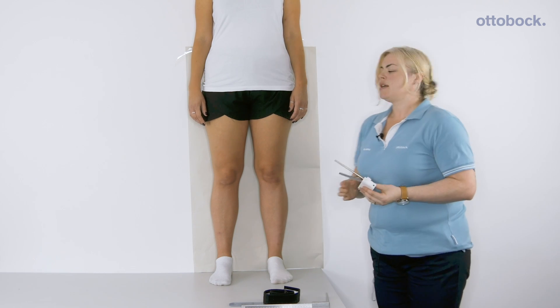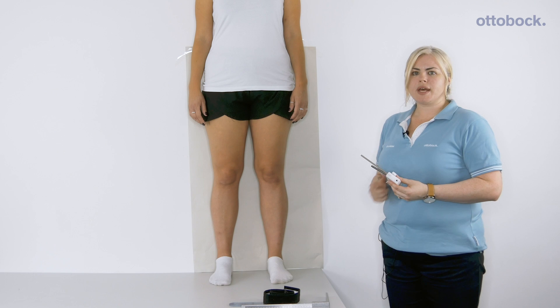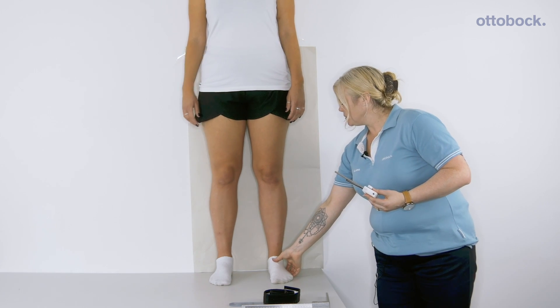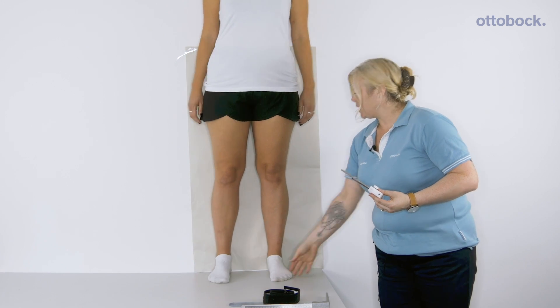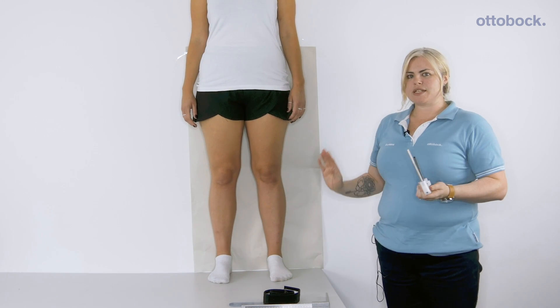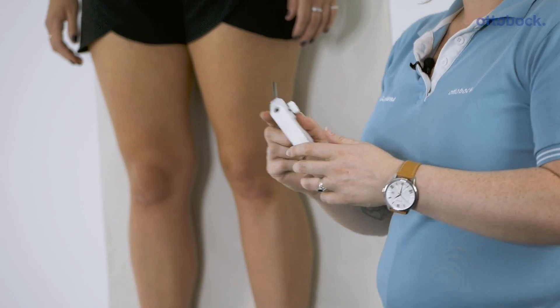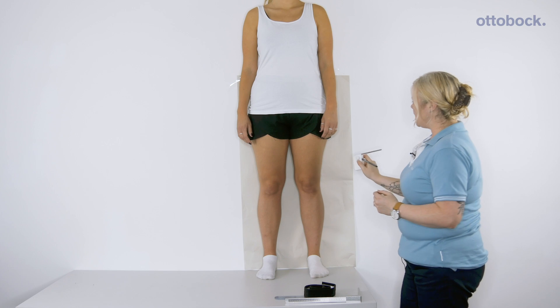Initially you will need tracing paper against the wall, with the patient's heel back against the wall. If there's any medial lateral correction, ideally try and position them up for the draught. Just make sure that the pen is parallel.